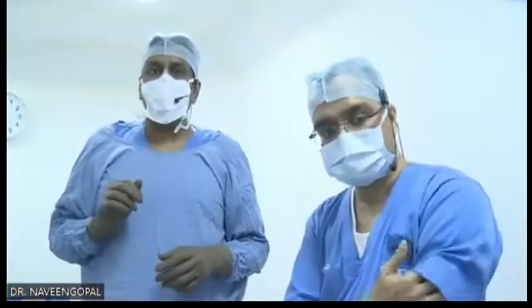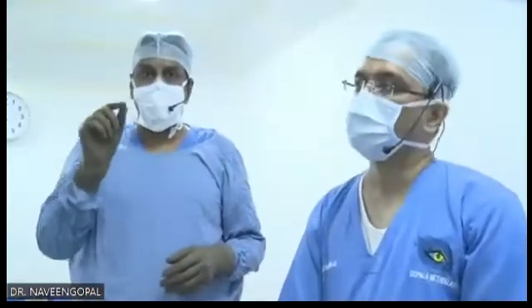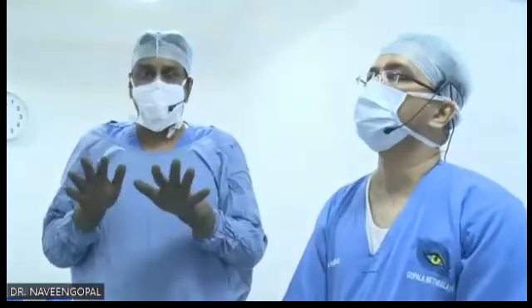I've had a couple of occasions where it had gone the other way around, which I had to remove. Yes, in my initial days, that is in 2011 or 12. I don't remember properly. That's why I told you 10 times you need to see the orientation of the lens. Each company has the hole on each side. Even now, even though I have put thousands of ICLs, I see the hole of the ICL and then put.